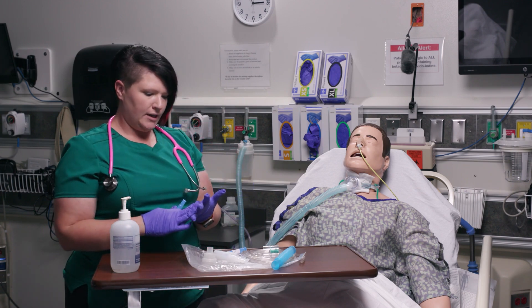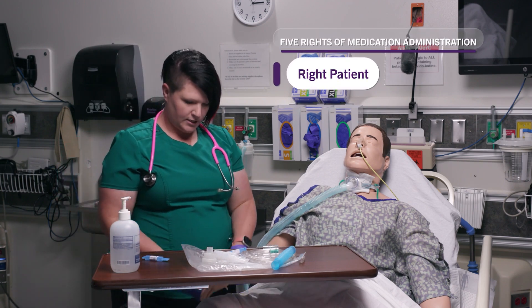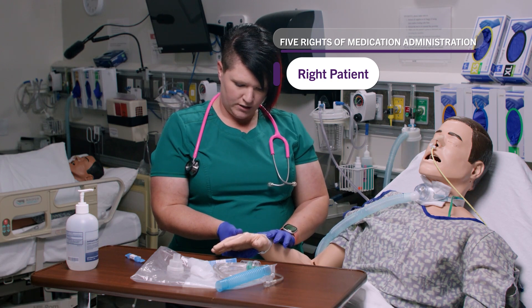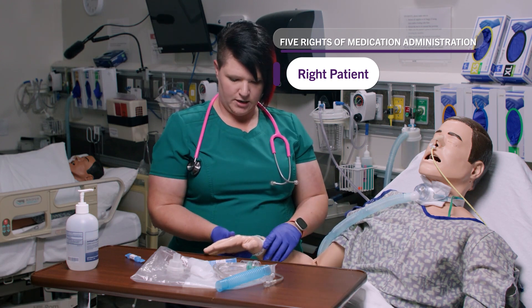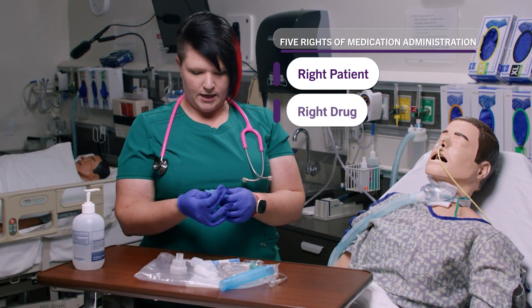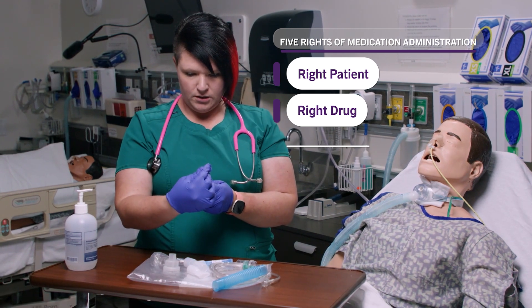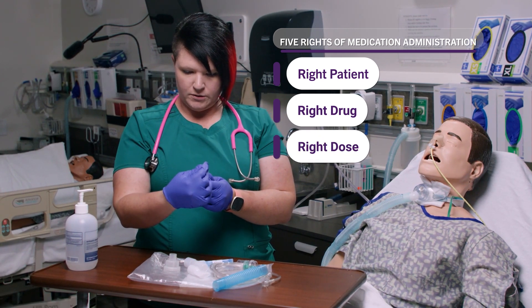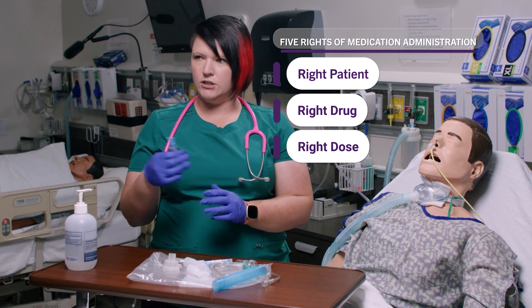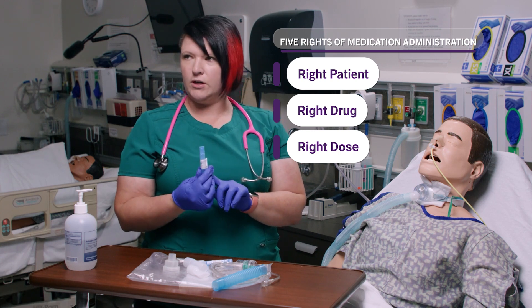Now I'm going to go through my five rights. The first is the right patient — I'm going to ask Mr. Jones to tell me his name and date of birth. I'm looking at his wristband as he tells me. Now I'm going to look at the medication — I have albuterol, 2.5 milligrams per 3 milliliters, and that is the correct dose on my medication sheet. So I have the right med and the right dose of 2.5 milligrams.